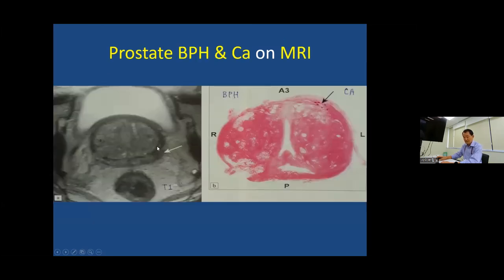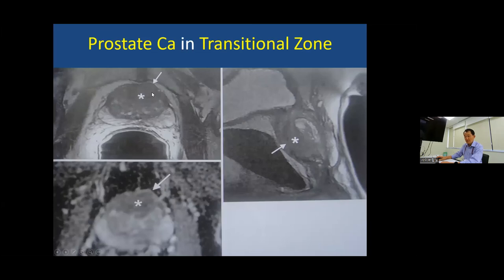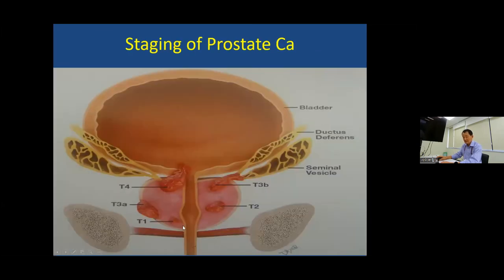So this thing, but here, but the tumor was also in the transitional zone here. These are all nodular hypertrophy. There's a benign prostatic hypertrophy, but cancer is also here, cancer. So here, a little bumpy, and it's here. So anything bumpy now, you have to worry about that. And certainly it makes a staging, depending on how extent.